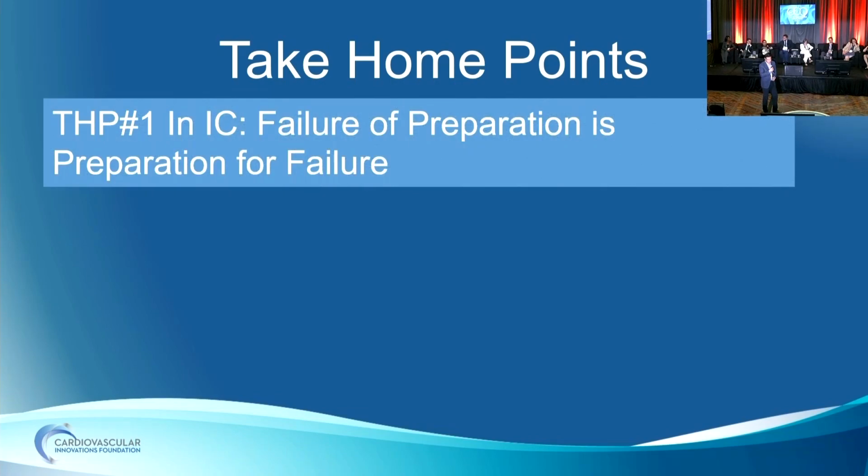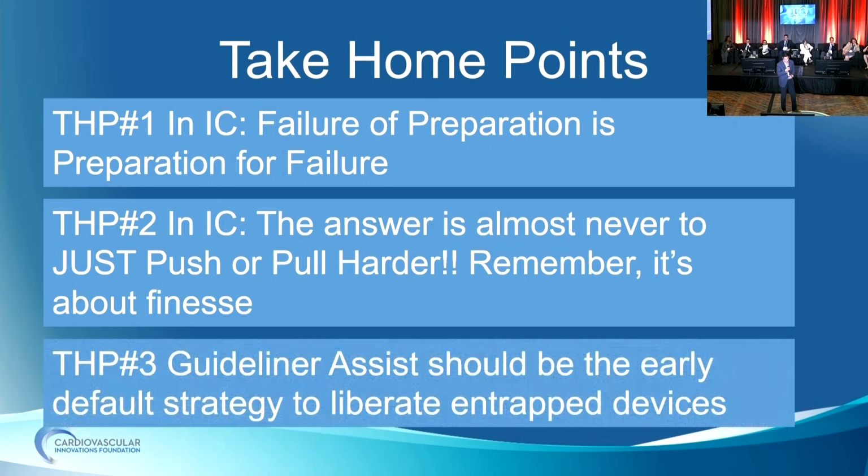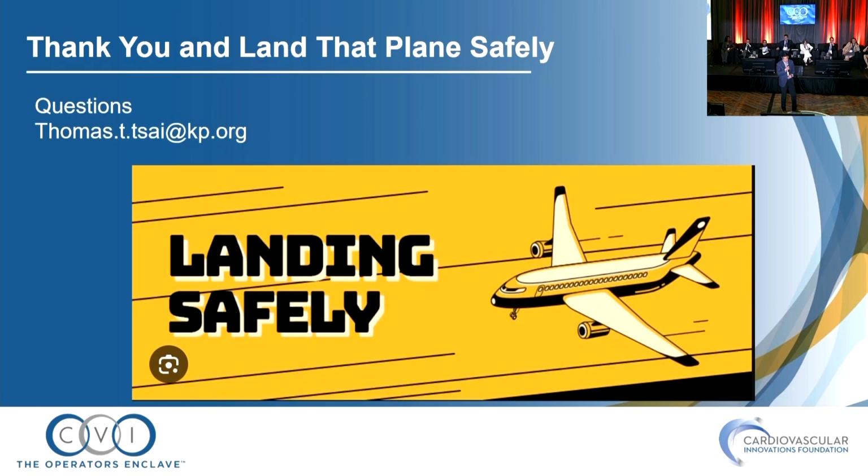So to finish up here, failure preparation is preparation for failure. The answer is almost never just push or pull harder. Remember the tolerance of our devices and the trouble you'll get into if you try and exceed that. It's about finesse. And number 3, I think the GuideLiner assist should be the early default strategy to liberate entrapped devices.